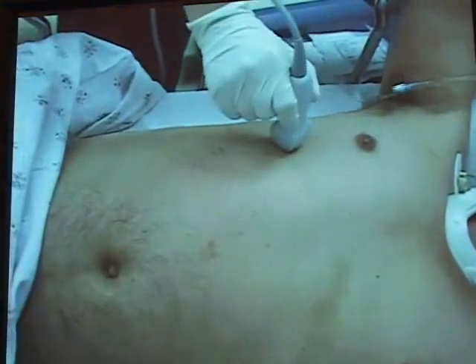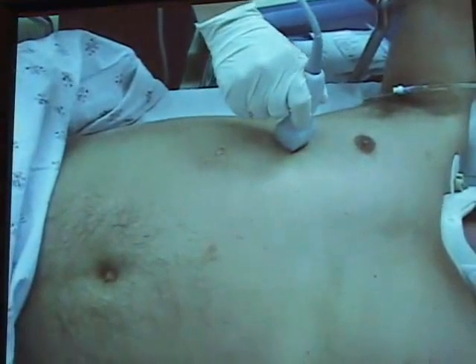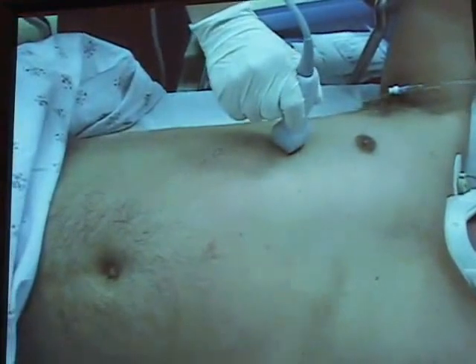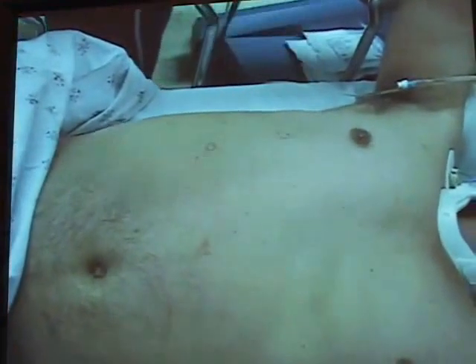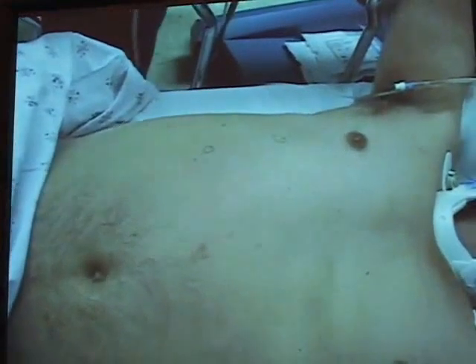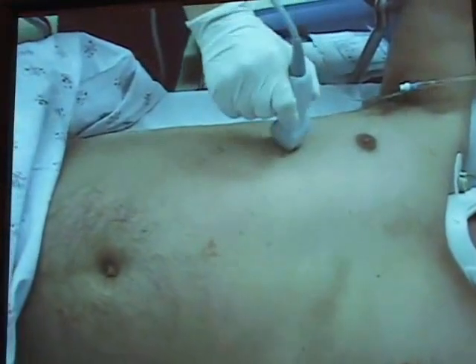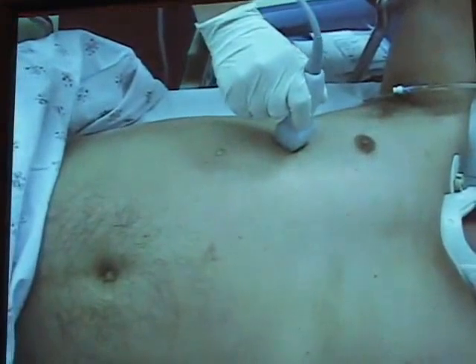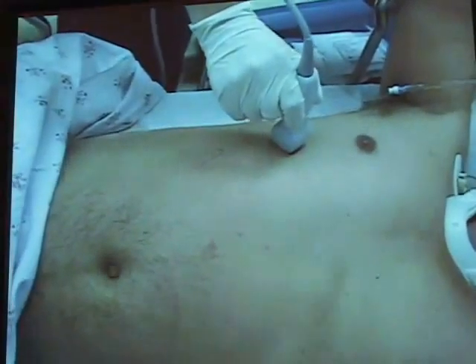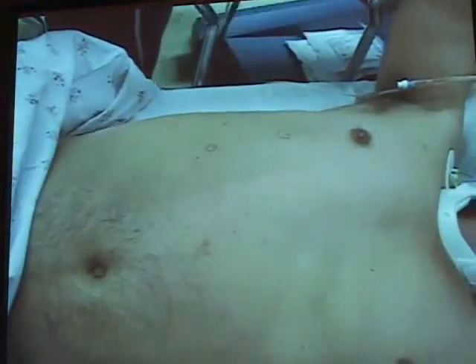Where to place the probe? There's lots of different possibilities given the variability of the location of the gallbladder. My personal recommendation is that you start looking intercostally in the midclavicular line as your first choice. So just draw a line from the nipple down and just go between the last few ribs. And a lot of the time, the gallbladder is just going to pop into your view.